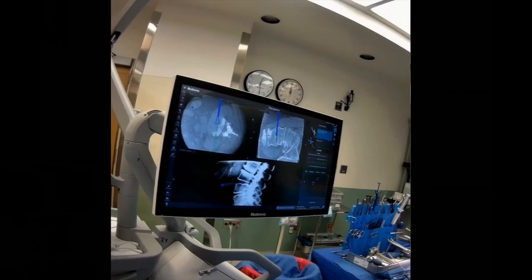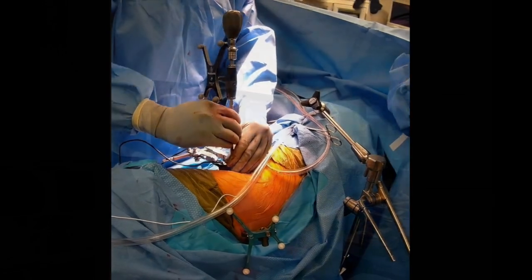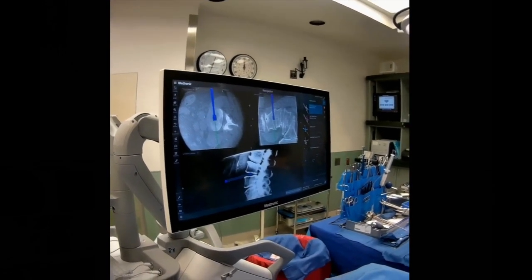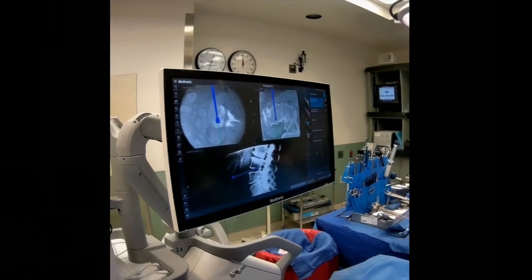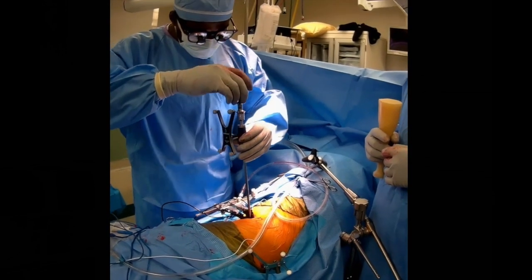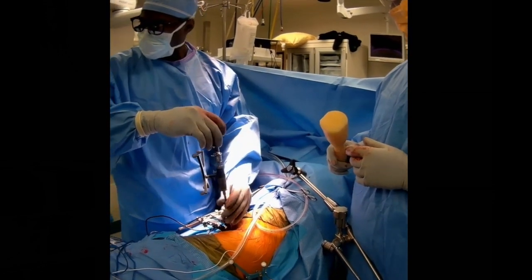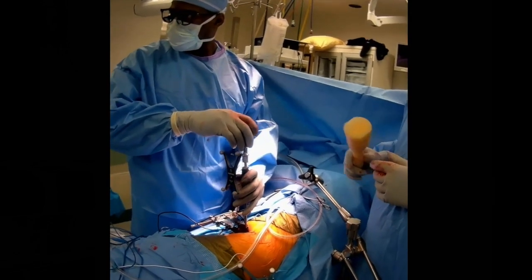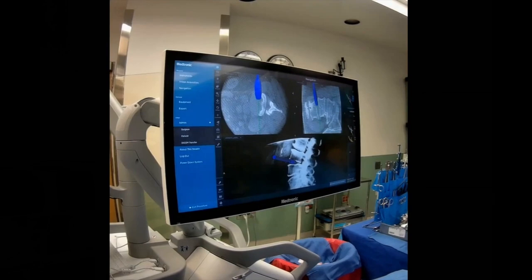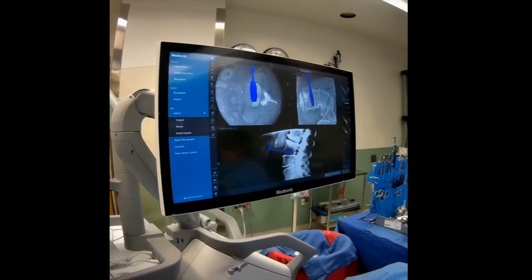Here you can see a ring curette going down and loosening further disc material and preparing the end plates. This is a navigated end plate shaver to prepare the end plates and remove all of the cartilaginous end plates. You can see here that the instruments are placed through the retractor in an oblique manner but then subsequently rotated outwards to a true lateral position. This is a trial being placed in a true lateral position despite the oblique approach.